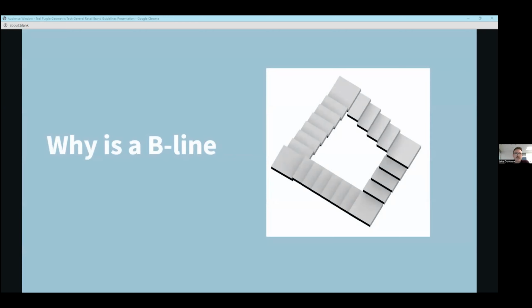So why do B lines happen? And again, real rabbit hole. I read so many papers on this. They published these laboratory studies where they're trying to recreate the artifact to determine exactly how it happens. And there's just nothing definitive out there on exactly what it is. What we have is theories that make sort of physiological and anatomical sense.